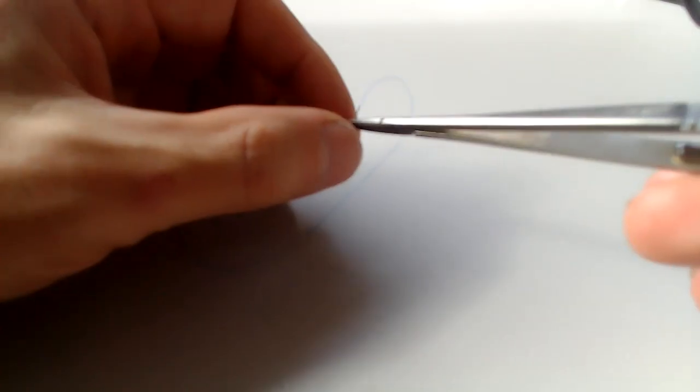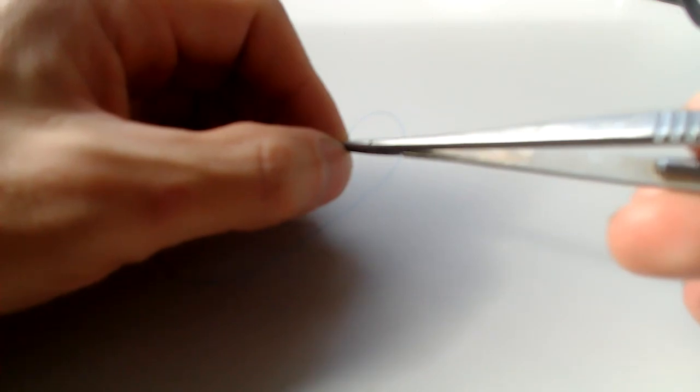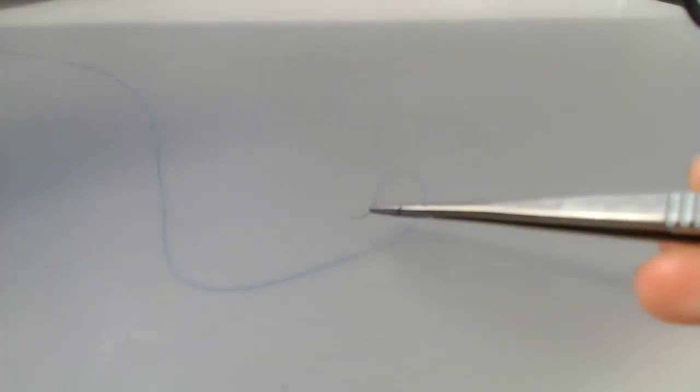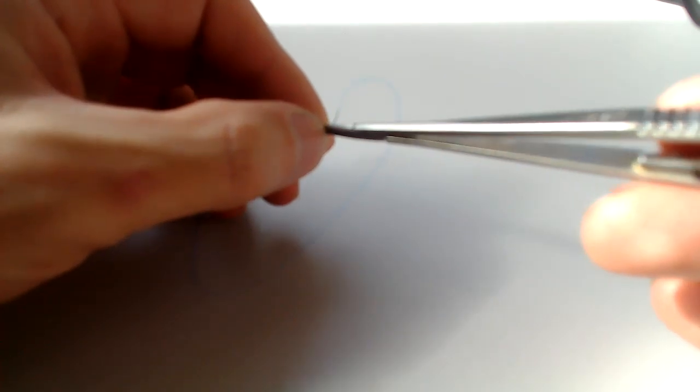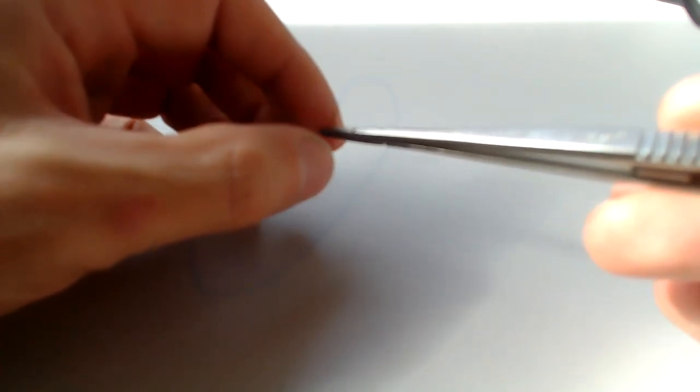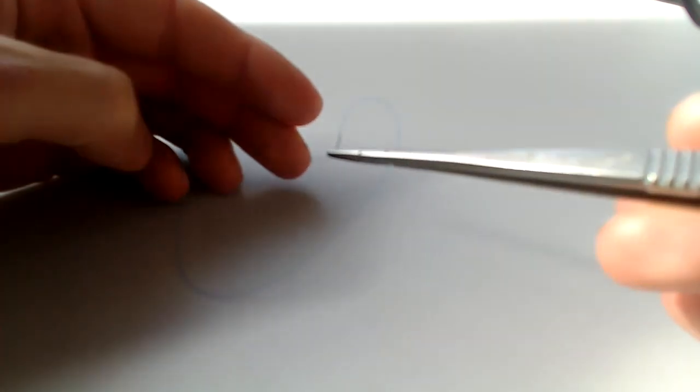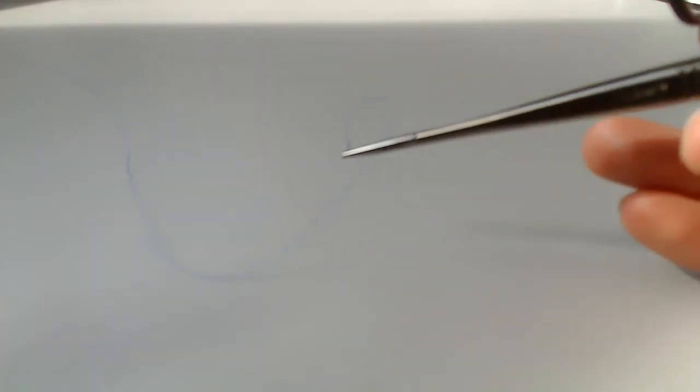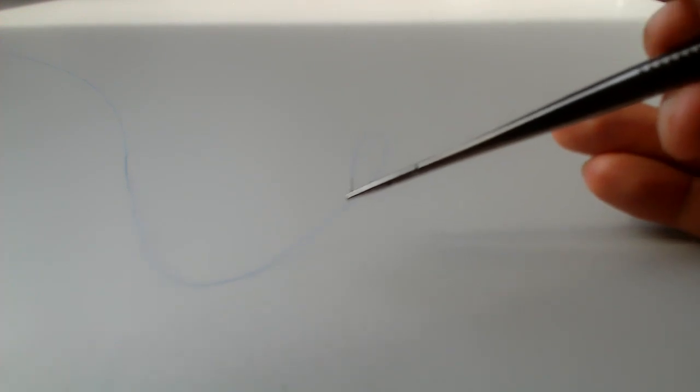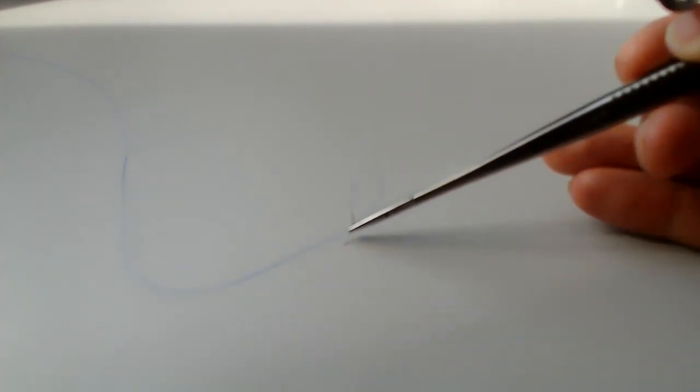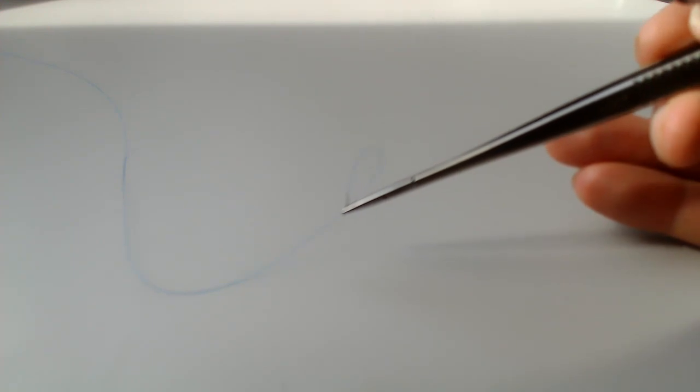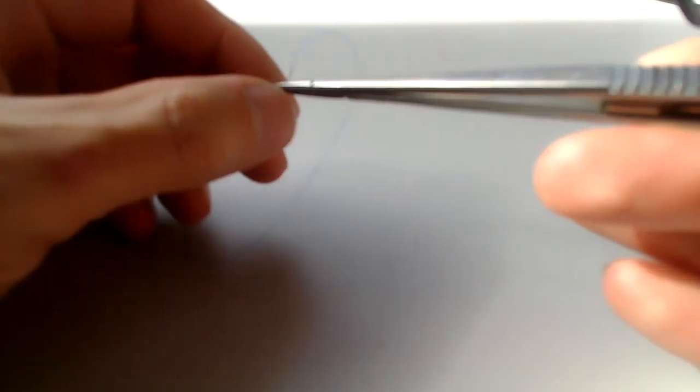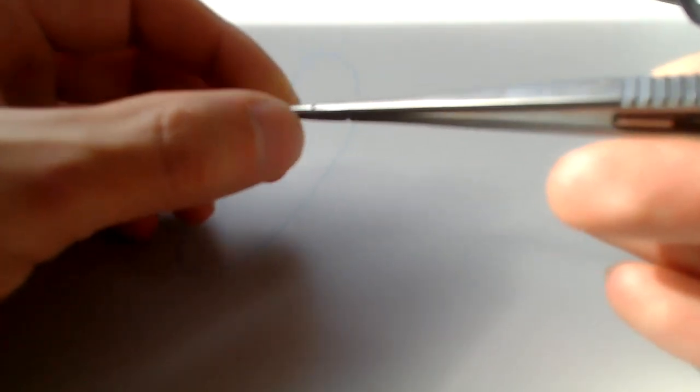So in general, about halfway on the needle length. I would say that most of the time I get the needle like this and I pretty much, once I get it, I pretty much always adjust it. I adjust the angle just very slightly, depending on the exact situation, the exact bite that I want to take. I'm looking at the bite that I want to take, and depending on exactly what I have in my mind, what I intend, I'm doing a little micro adjustments on the needle.